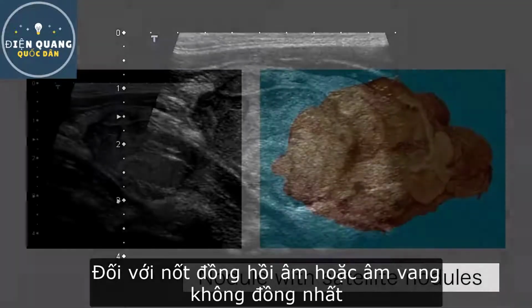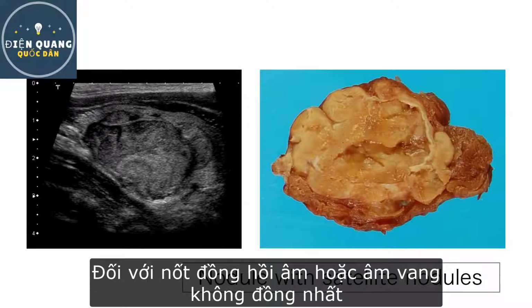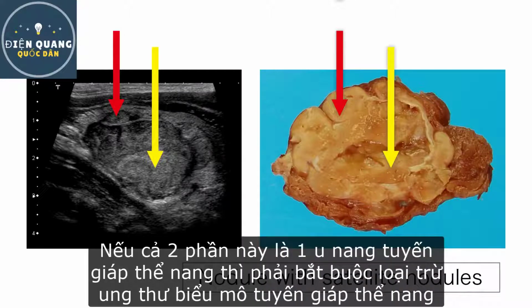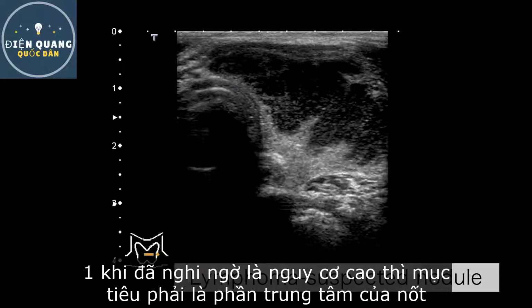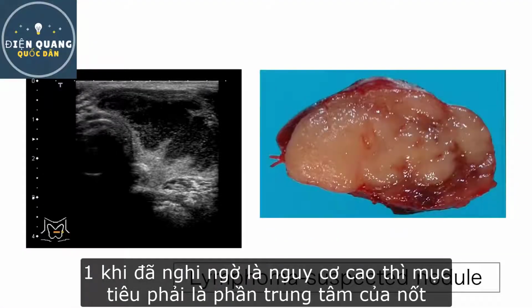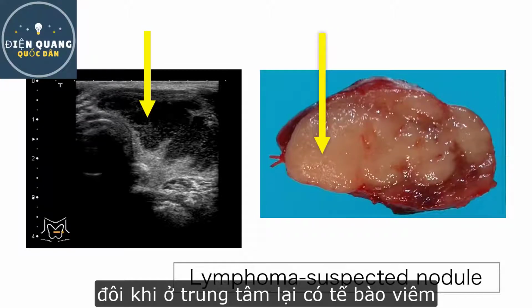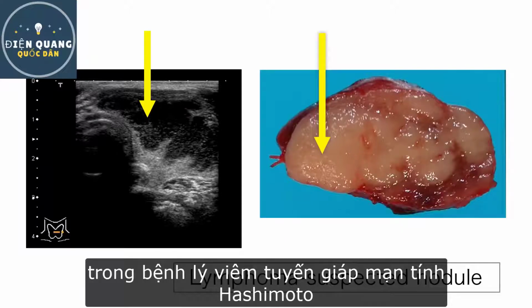For the nodule with other satellite nodules, we perform aspiration in both the main and satellite nodules. If both are follicular neoplasm, we can suspect follicular carcinoma. When lymphoma is suspected, the target area is the center of the nodule. The samples obtained from its periphery may be confused with Hashimoto's thyroiditis.